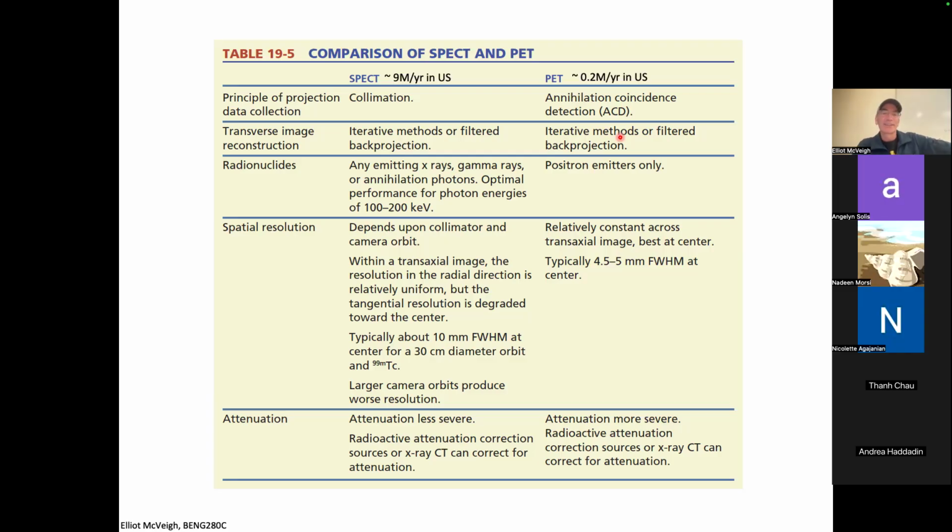So as you can imagine, vendors jumped all over deep learning because they can do these iterative models on essentially example data, millions of images, and train deep learning to just do it from the raw data, right? Just get this raw data and this image from that. And so that's been done. And so now the cost of reconstruction is plummeting, right? So you can do quick reconstructions on small computers just using networks that have been built.